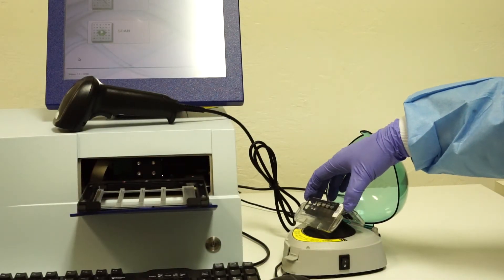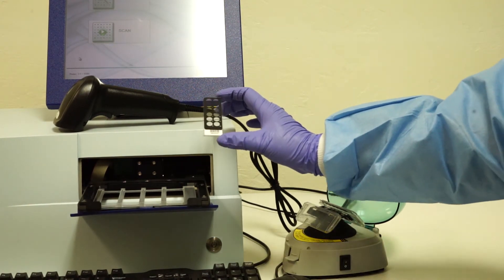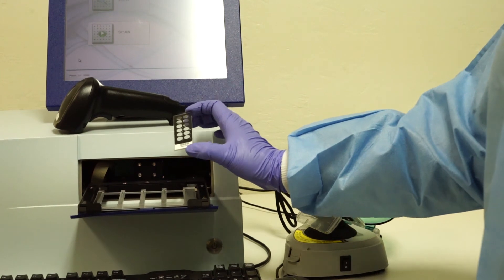Once the slide is dry, remove from the centrifuge and turn on the Sensivation imager. The slides will be loaded from left to right to read.